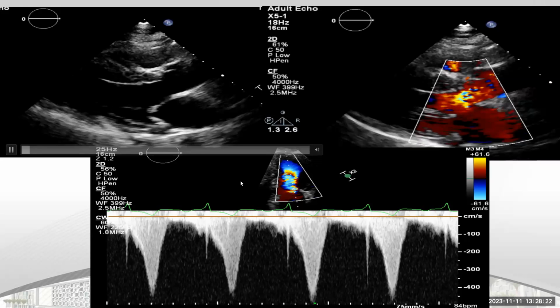We have many other phenotypes, like concentric HOCM. In concentric HOCM, we may have more than 15 millimeter, it may reach 20 or 30. However, 30 is an indication for primary ICD if you have no other indication. This is one of the strong indications. But for the thickness, you have to have 14 or more millimeter.